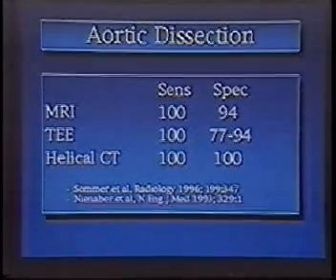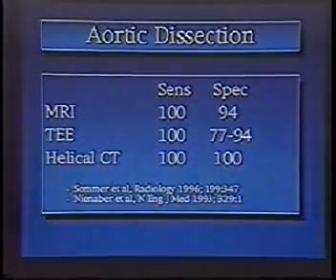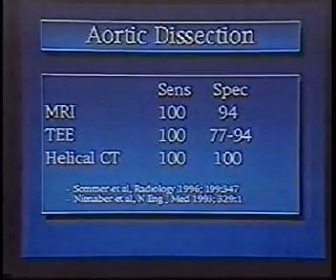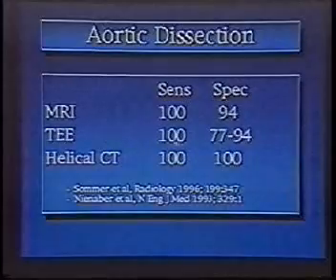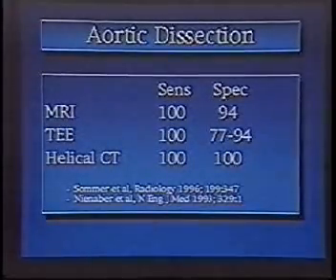Transesophageal echo is also used, especially in the critical setting where the patient can't be moved to radiology, and in the OR, for example, once the patient is diagnosed with a dissection by CT or MR, the patient goes up to the OR for a type A dissection. Then they look at the aortic valve to see if that's involved in the function of the aortic valve. And they look at other things at the time, just before surgery. So TEE tends to be used too often, and I would recommend using CT or MR. You don't have the choice. As I said, the cardiologists, once they grab hold of the patient, they don't like to let them go.